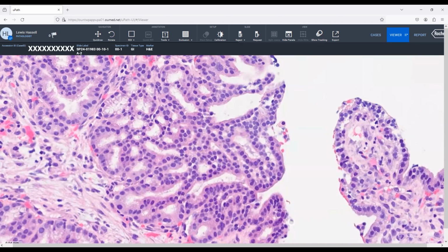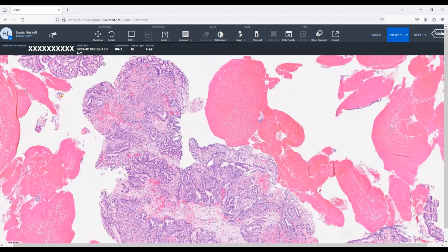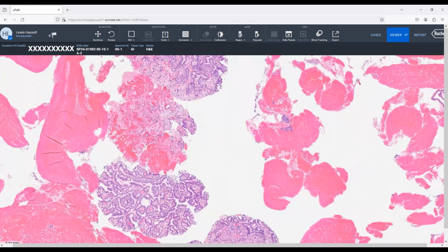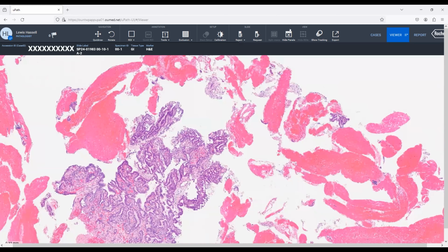I mean, you could imagine this being a biopsy of a bile duct and seeing these as sort of peribiliary type glands. And there is, of course, some inflammation and other features going on here, but no frankly invasive or desmoplastic reaction in this tumor, but a large amount of intrahepatic growth, or the intraluminal growth of the sort that we have described.